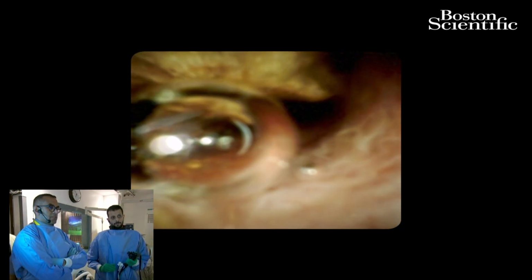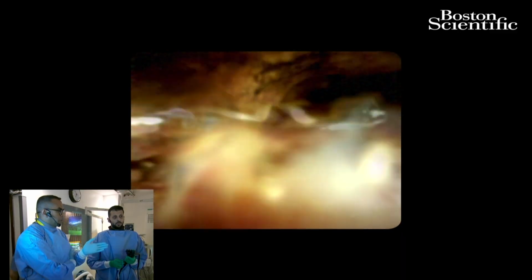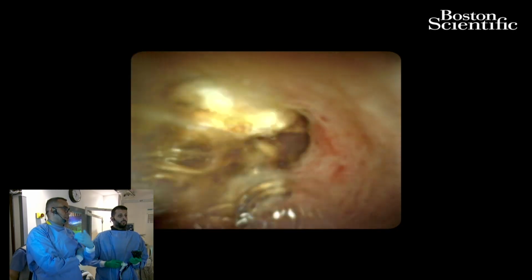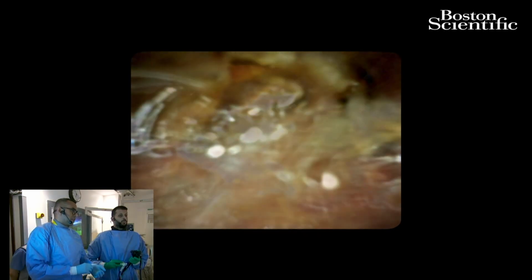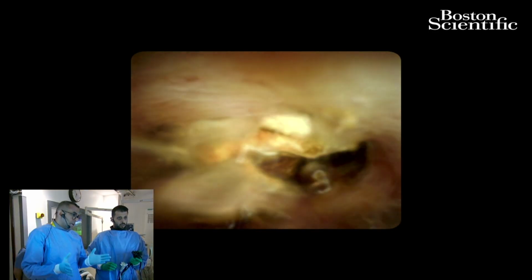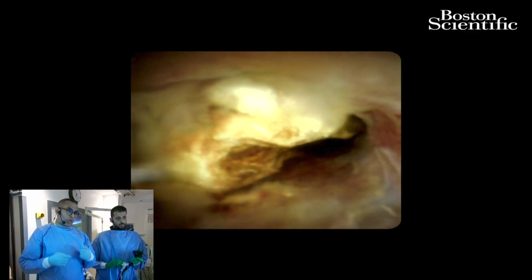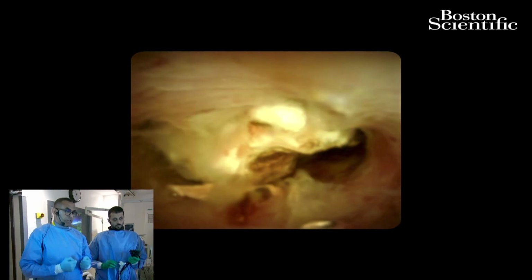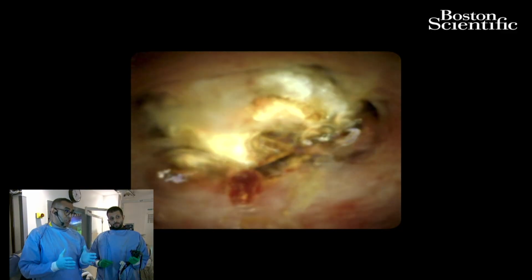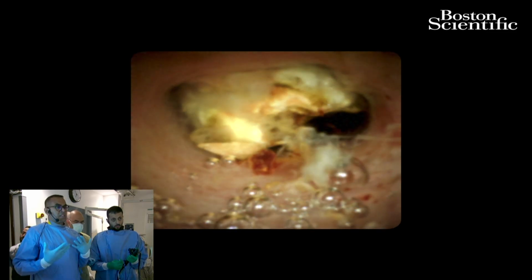And one thing also, Saad, I completely agree with your point. If it's a stone, this is a completely different game. You could try one, two, three ERCPs trying to clear it before you think about sending the patient down the road to a center where they have the spyglass, or even using a spyglass yourself. However, if we are dealing with strictures, time is of the essence. If you miss that stricture at an earlier stage, where you can actually do something about it, especially if you can refer the patient to surgery for curative resection, you are dealing with very limited choices after that, when the disease is advanced.